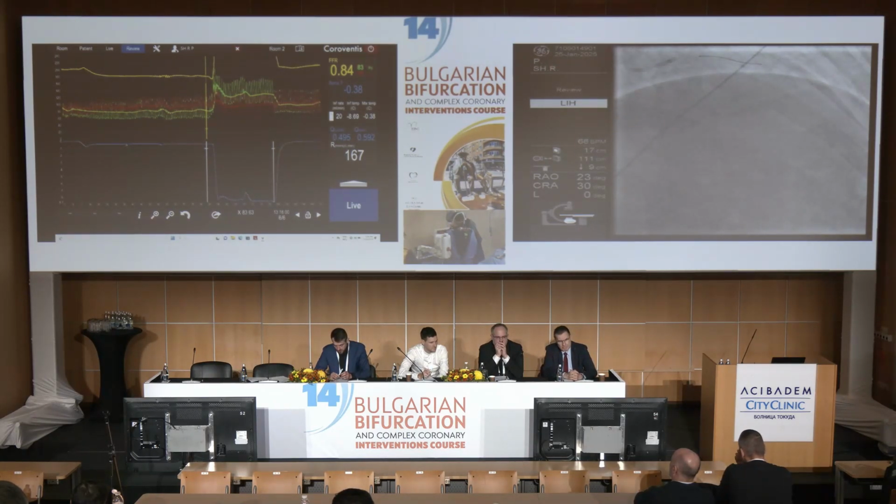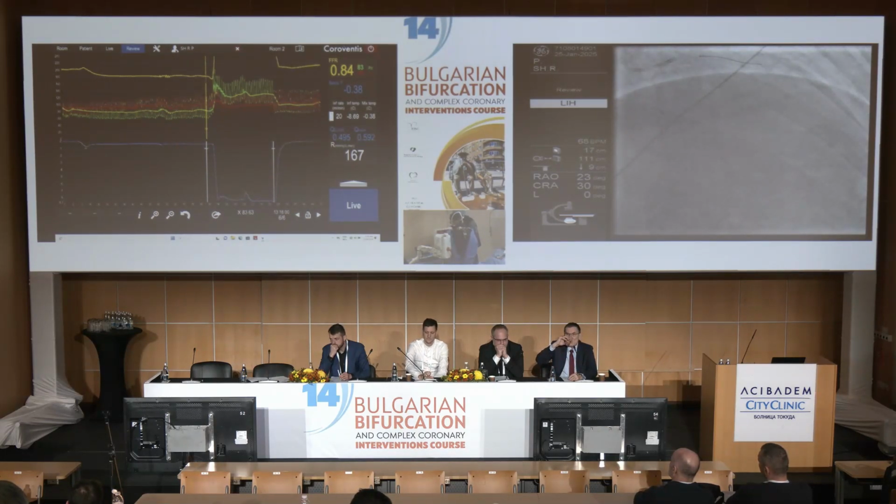And actually you have seen we have waited a long time, for educational purposes, but we could have stopped already here after 10 seconds, we were done. And this tells us that the 20 milliliter were delivered in a system which was not yet vasodilated, and therefore, of course, the temperature goes down much lower and comes back once it's vasodilated.